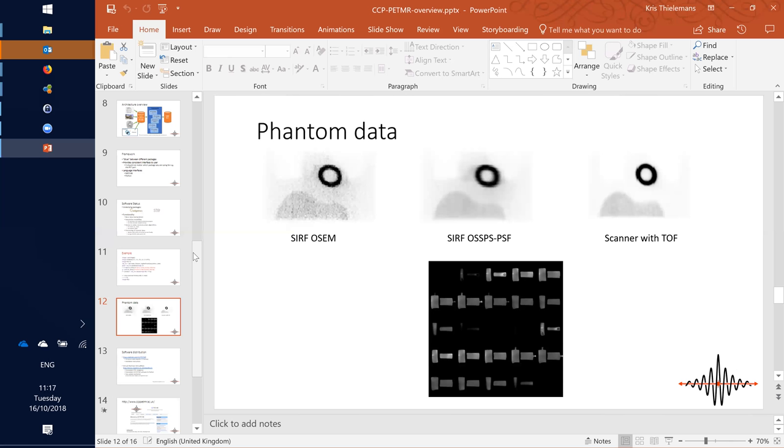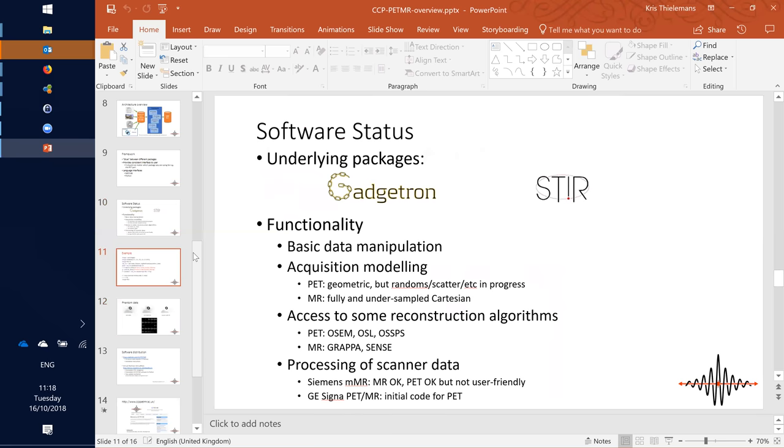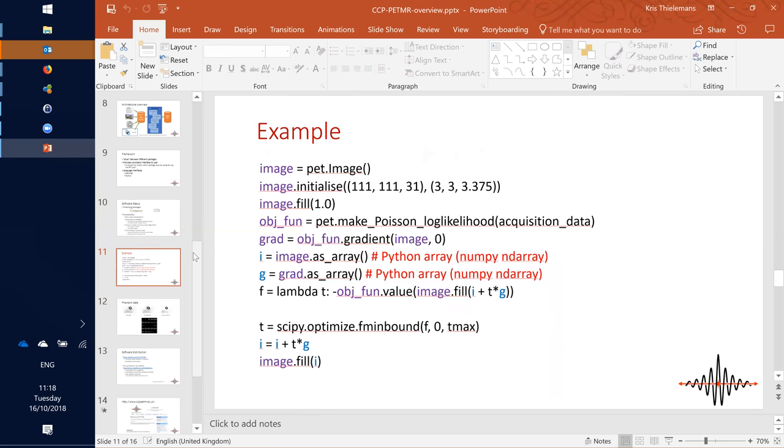Yeah, because the main difference, as you say, will come from the optimization step, which is served differently in STIR and CASToR. But for all the different lines you showed in STIR, when you suggest, say, the dimensions and everything like that to initialize, if you are using CASToR, it can just output the different parts of the command line. Right. So it may not be too complicated.